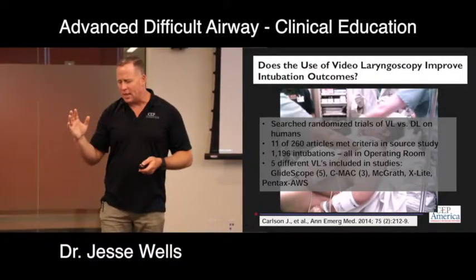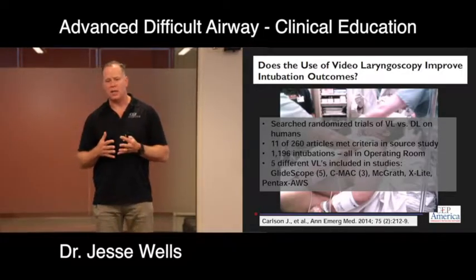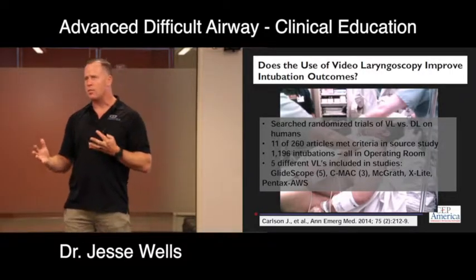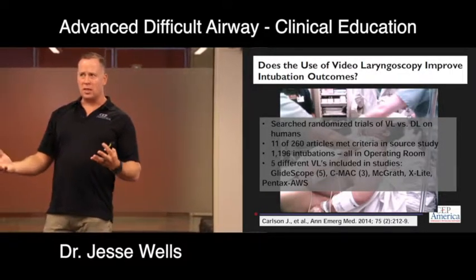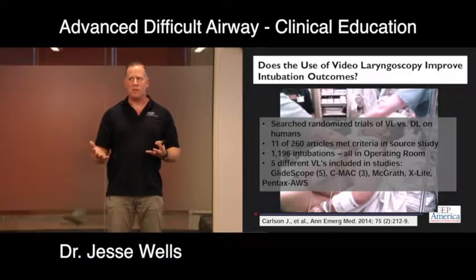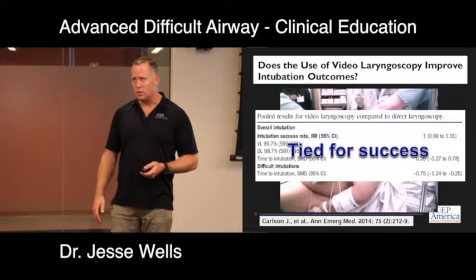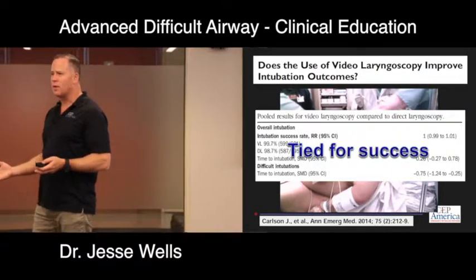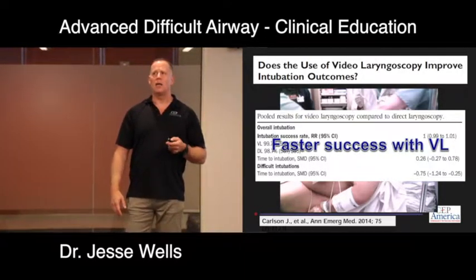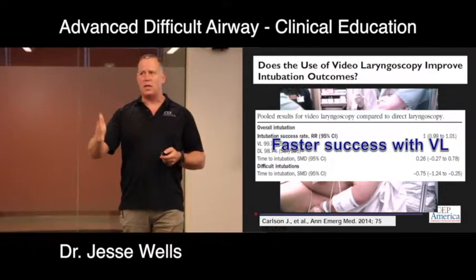So this was a meta-analysis that Annals published, but it was originally published in a European journal, and it looked at, for difficult airways, it compared video laryngoscopy versus direct laryngoscopy for predicted difficult. And there ended up being 260 articles that they found. 11 of them met their criteria, ended up with about 1,200 intubations. They were all done in the operating room, all done by anesthesia, and their grand conclusion was that they were tied for success for difficult airway. There was no advantage of video laryngoscopy for predicted difficult airway in terms of overall success, but they were faster intubating with video laryngoscopy.